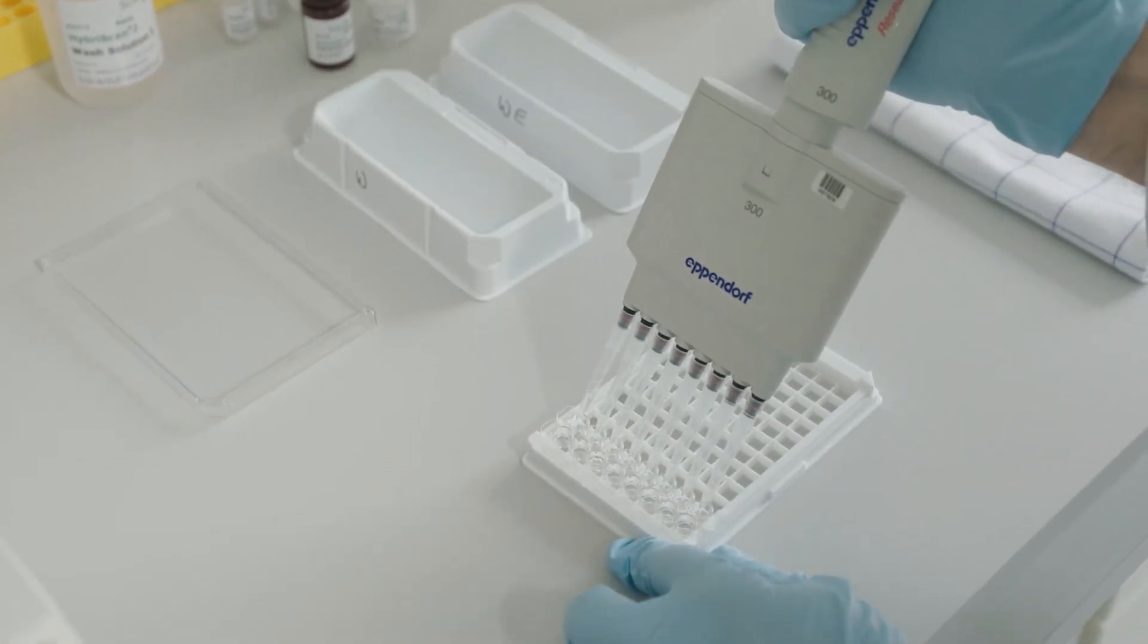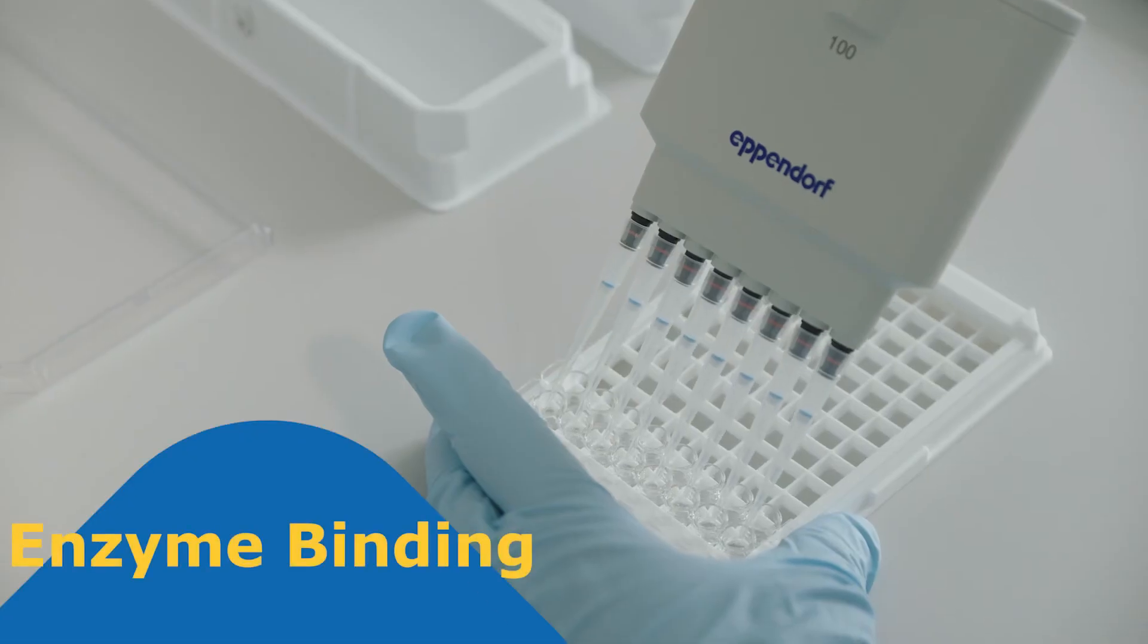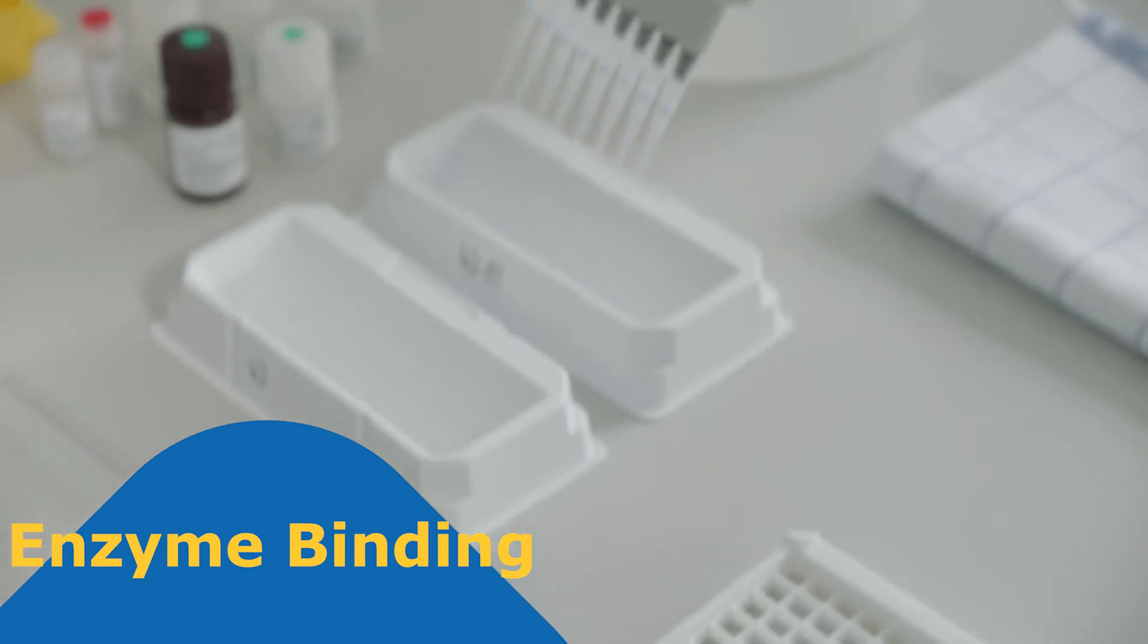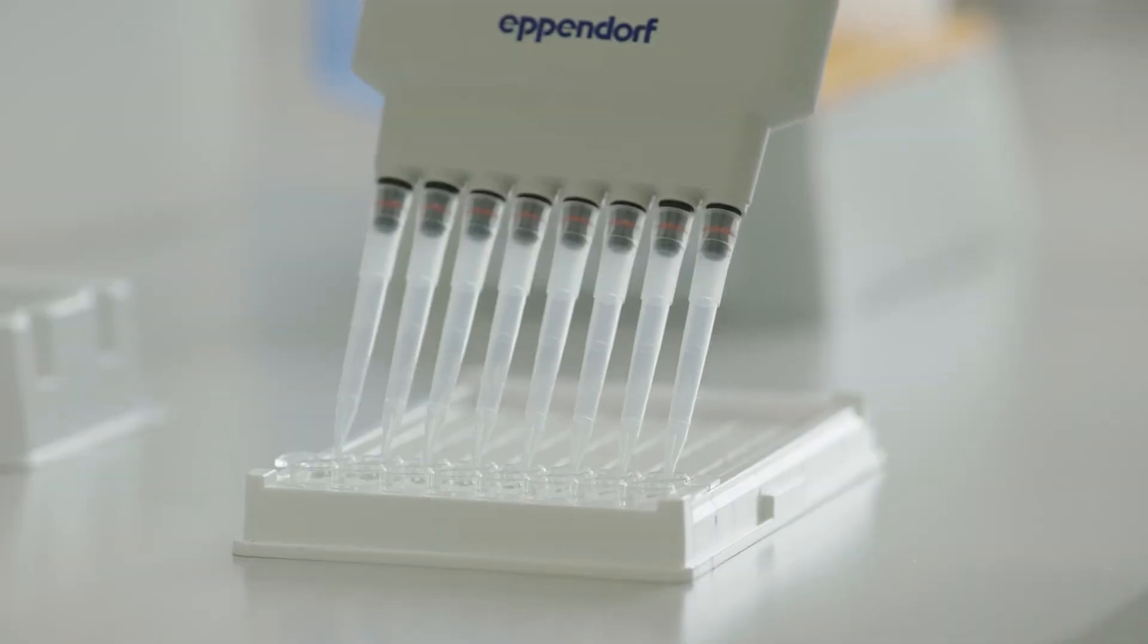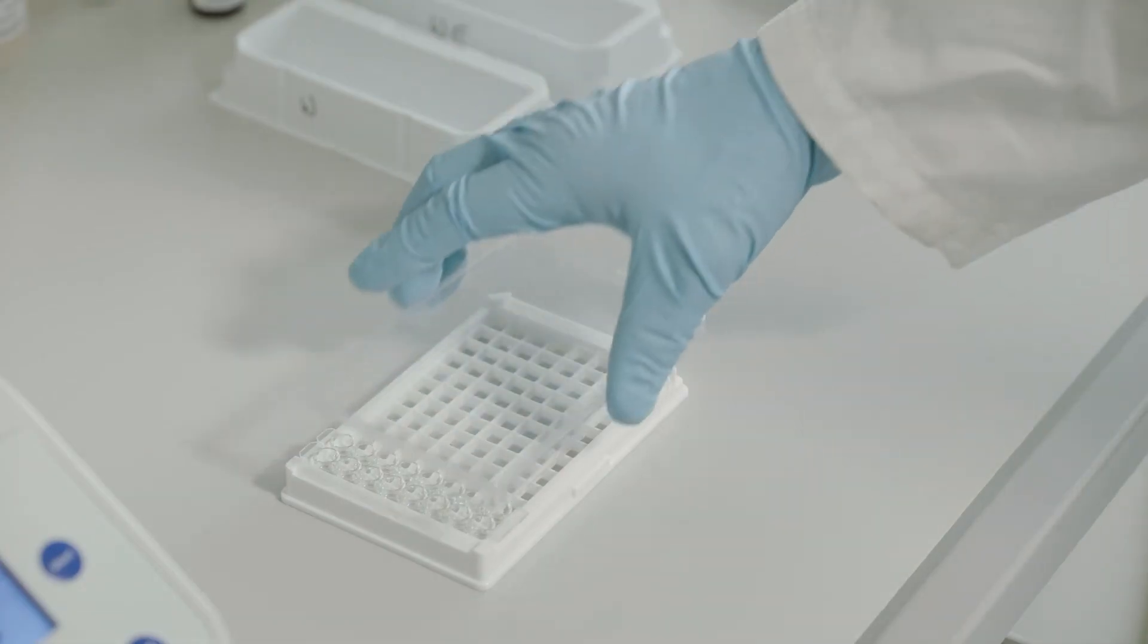Next, the enzyme is bound to the immobilized complex. Prepared enzyme solution is given into each well. The microplate is then covered and incubated for a further 25 minutes.